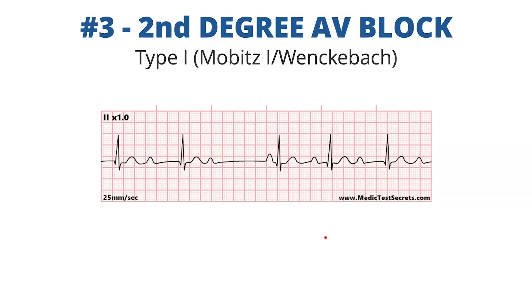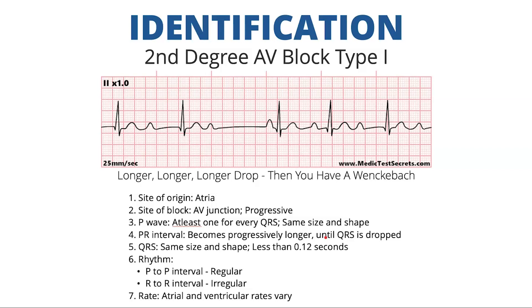Next we have second degree AV block type one. This can be called either a Mobitz one or a Wenckebach. To identify second degree type one, the heart block poem is: longer, longer, longer, drop — then you have a Wenckebach. One of the big things with this rhythm is the R to R interval is irregular. What I like to do is look for that dropped beat. You see the complexes marching along, and it looks like the next one should be right here, but it's not — that's our dropped beat.